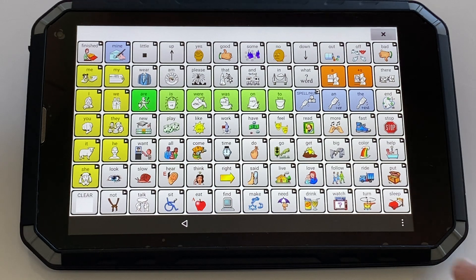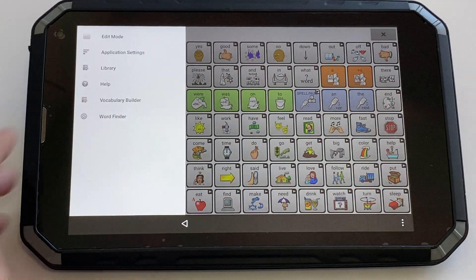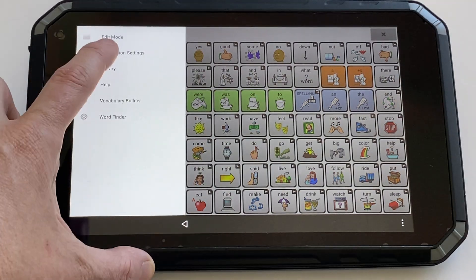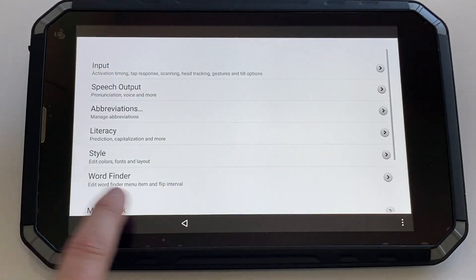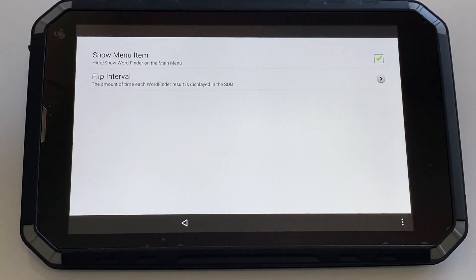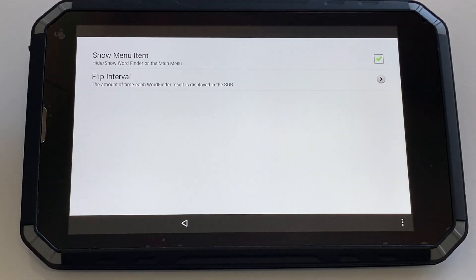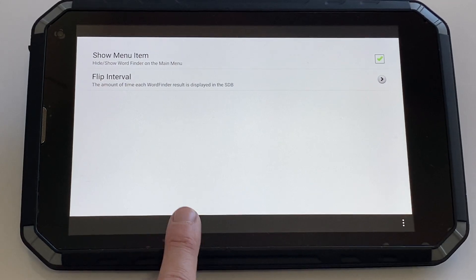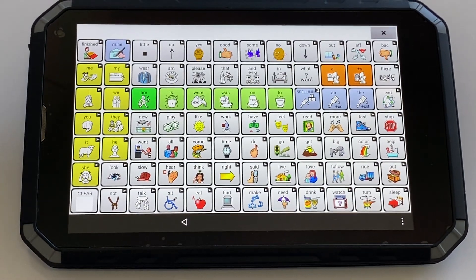If you don't see the word finder functioning, you may need to turn it on in settings. Click on the three dots, go to Application Settings, then Word Finder, and make sure that it's ticked. Use the back arrow to get back to your vocabulary file.